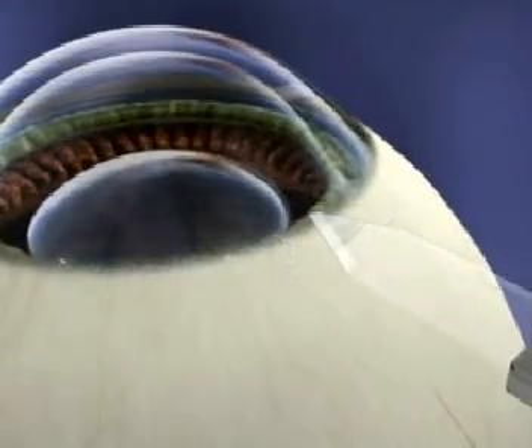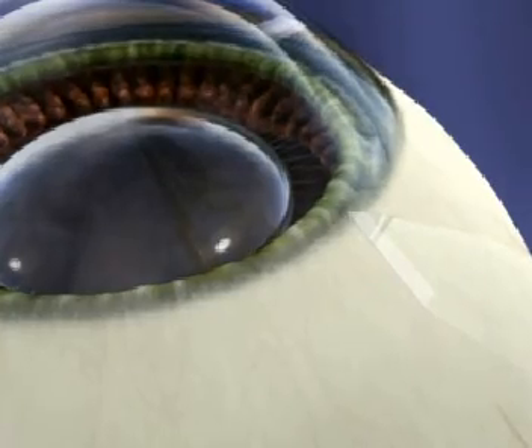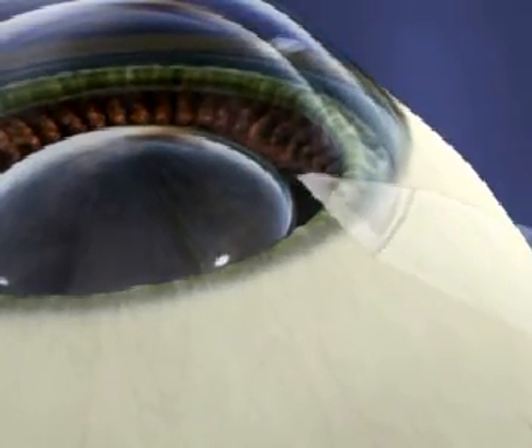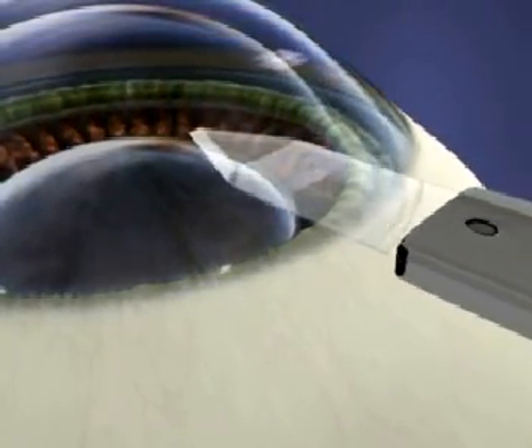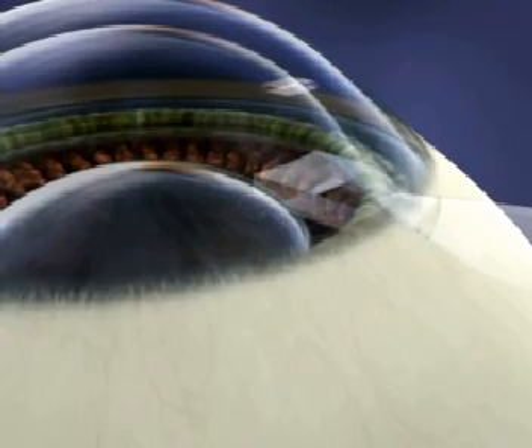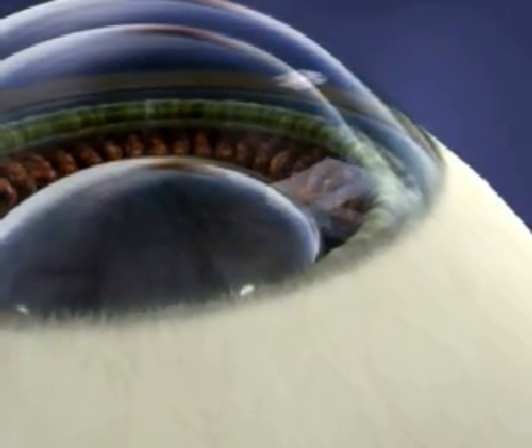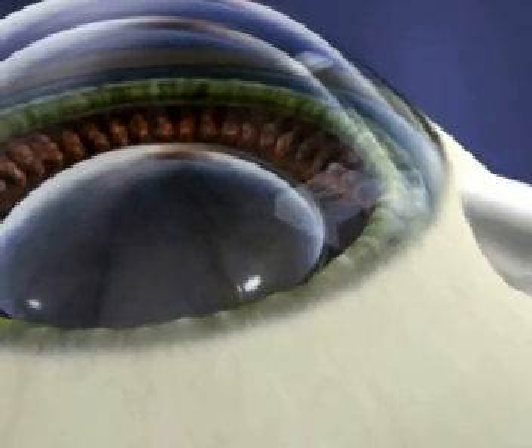When making the clear corneal incision, the temporal approach orients best to the iris plane. This prevents inadvertent touch of the crystalline lens. Using a knife you're comfortable with, make a slow and controlled entry. The clear corneal incision should have a cord length of 3 to 3.2 millimeters, with a 2 millimeter tunnel on a parallel plane to the iris.